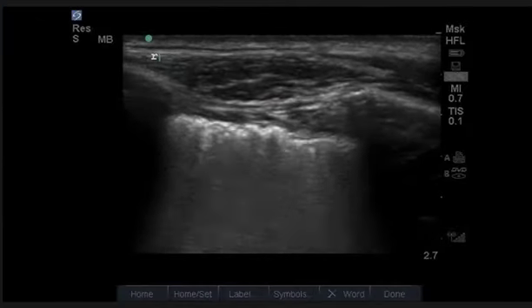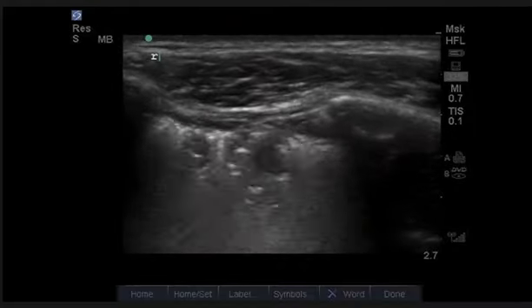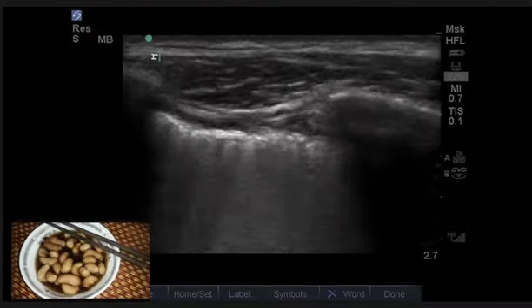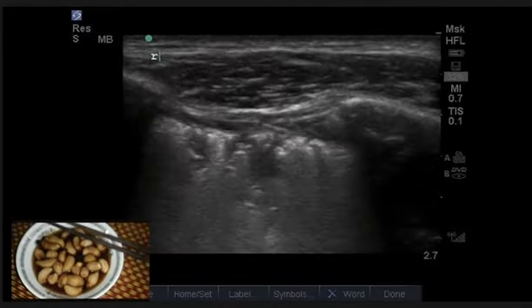Well, what's this? Well, there's an irregular pleural line, but also, what's that? A pneumonia. So this shows hypoechoic areas with some areas of hyperechoic within it. Jess Schmidt likes to call these lungworms. When you have dynamic air bronchograms, this is suggestive of pneumonia. You have a black area with black tubes and white stuff in them moving around as the person breathes.